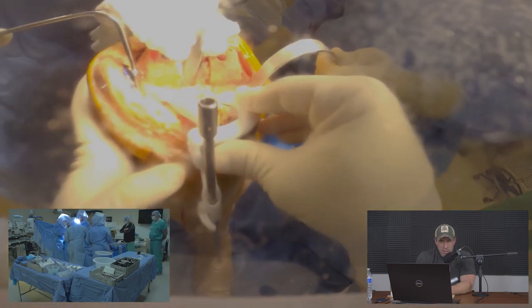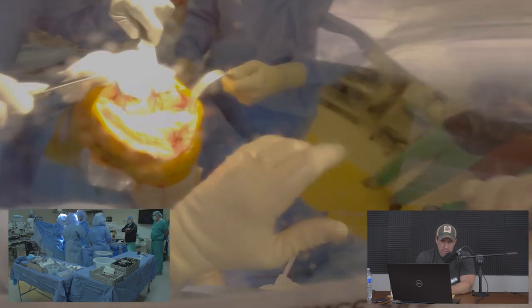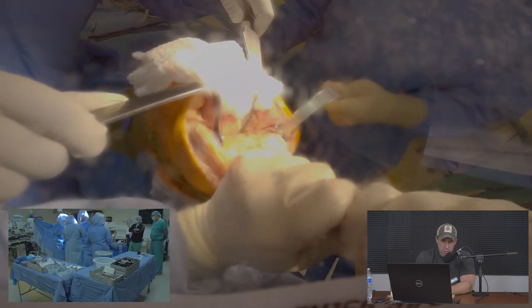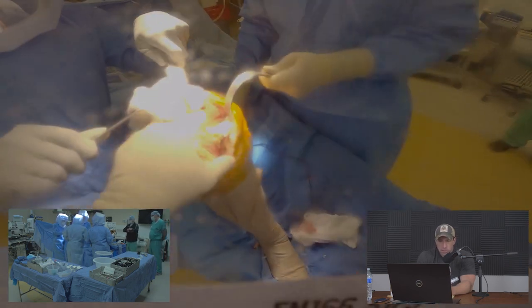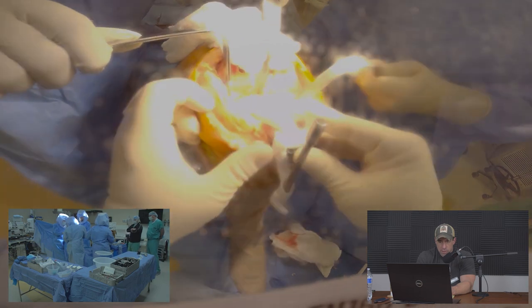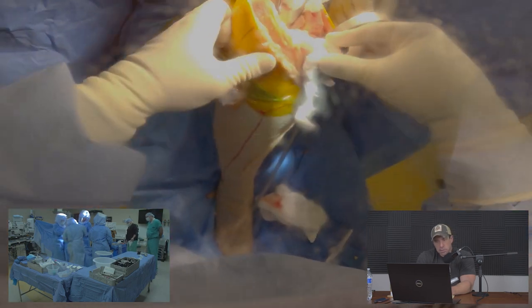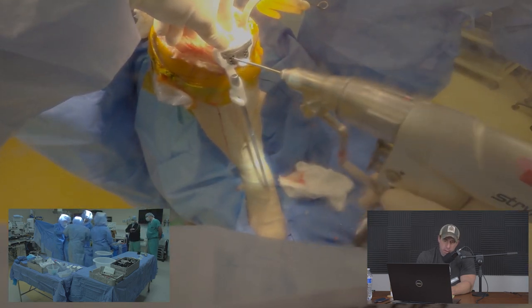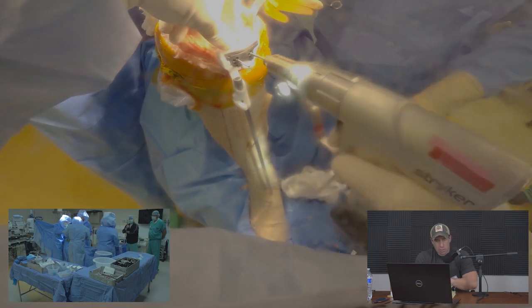This is the T1 tibial block — the feet on the bottom have been painted with a marker, showing contact points on the tibia. We remove cartilage at that level to reference off bone. This system is built on CT-based imaging which references bone rather than soft tissue like MRI, so we must get down to good bone. The block is then pinned into position for a flat neutral cut on top of the tibia.